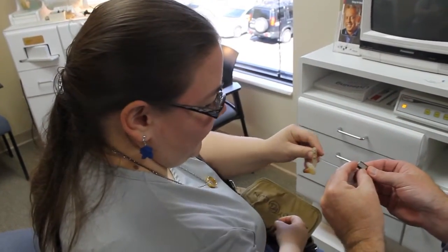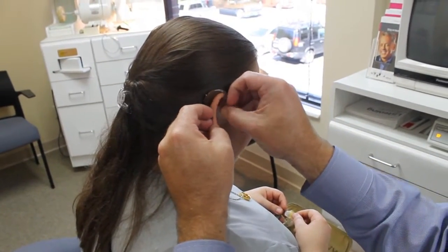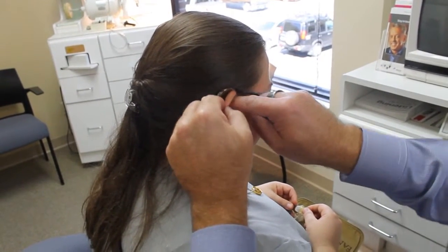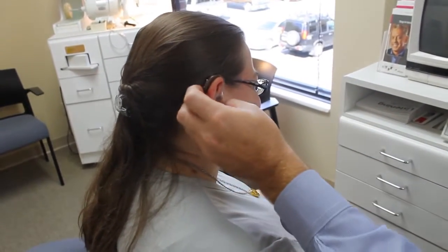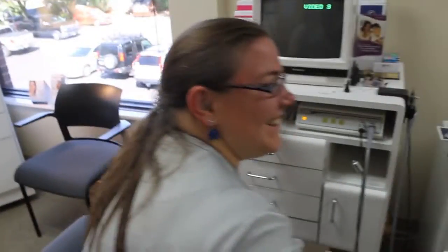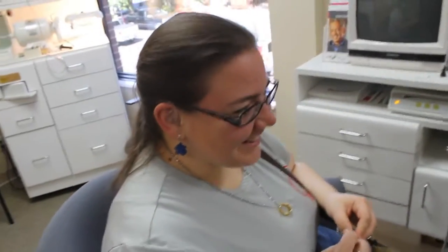All right, now I'm going to reset this. Oh my gosh, it sounds like an organ. How does it sound, hon? Does it sound okay? New hearing aid. Now, let's make sure we want to get you in stereo here. I'm going to let you slip that in first.